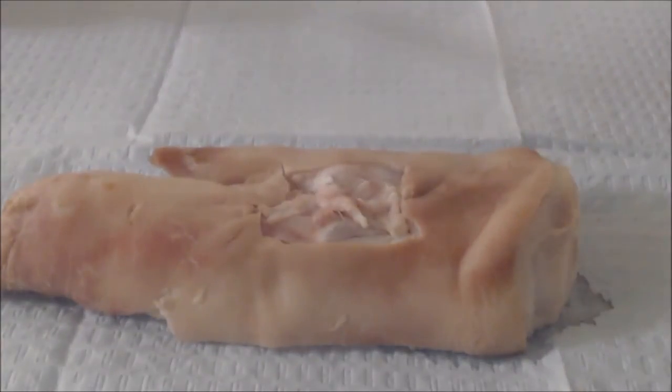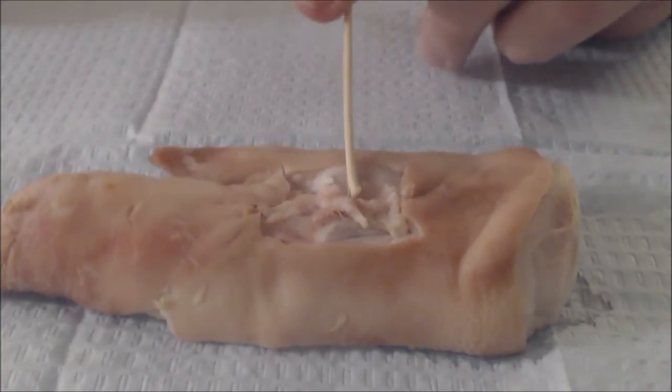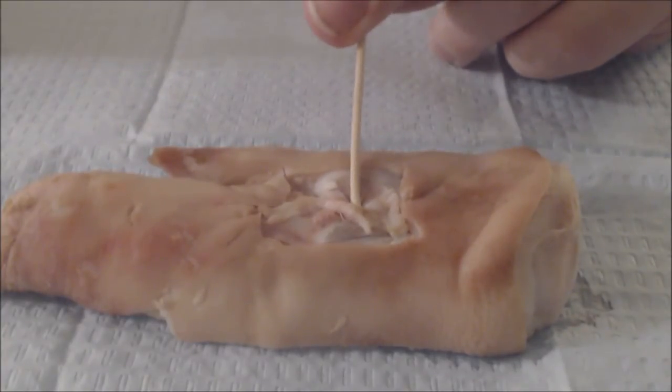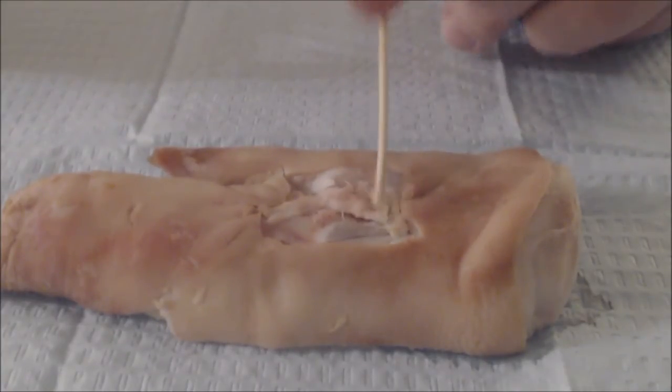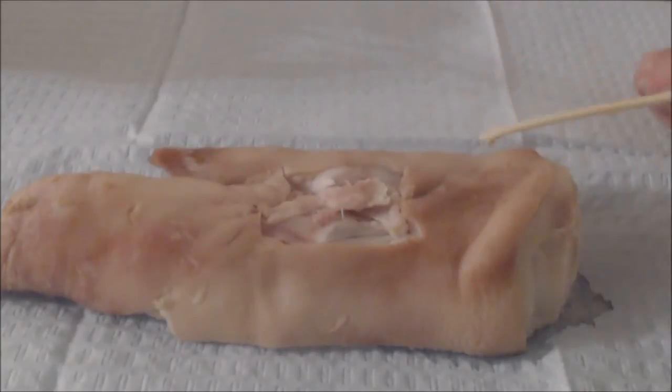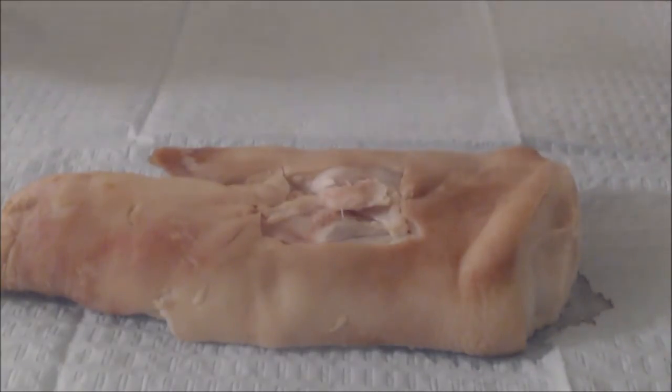Simply cut out an area to practice in and pretend that you have an area, probably here in the middle, that you think most of the bleeding is coming from. Venous bleeds don't squirt out blood, so it's really tough to tell where the bleeding is coming from — what they do instead is fill the entire wound up with blood.